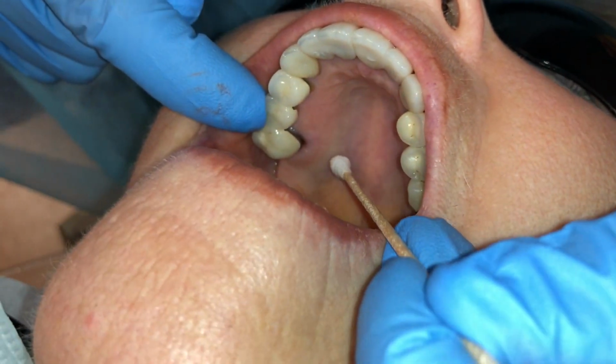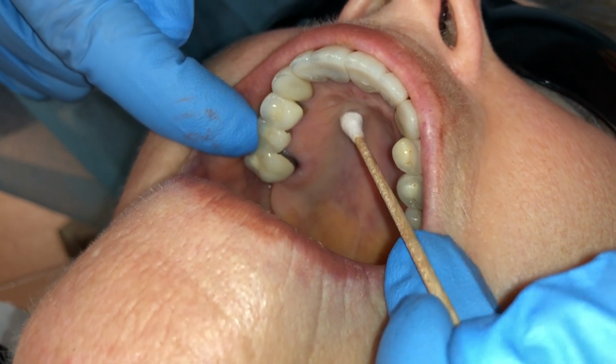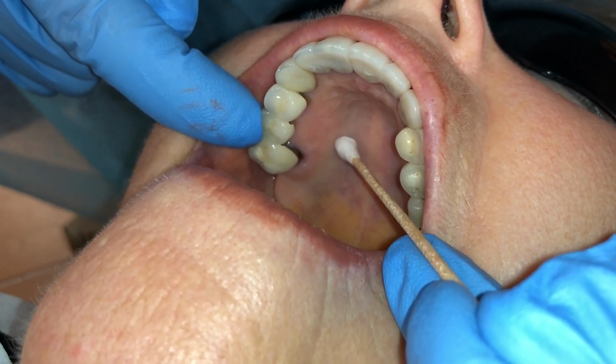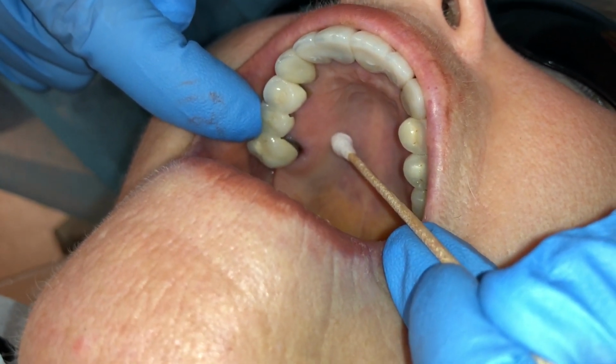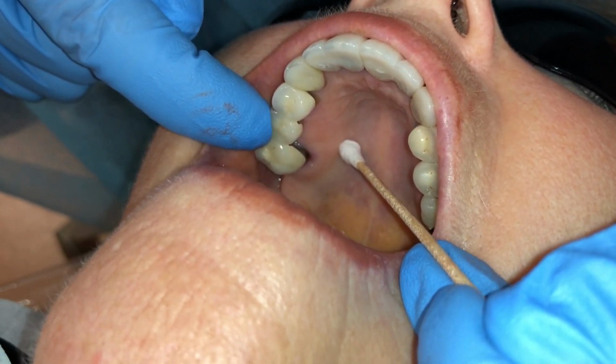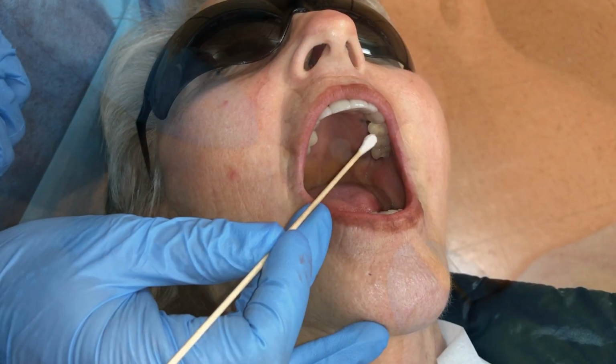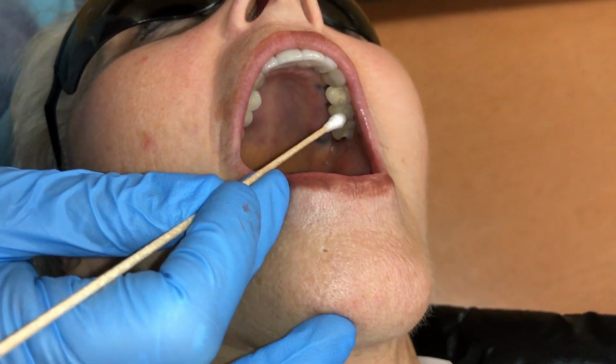It is helpful for the clinician to probe the soft tissue from a perpendicular standpoint to identify a spongy location that can accommodate a larger portion of local anesthetic. The palatal bone is porous and has nutrient canals, which allow for diffusion to the dental plexus.